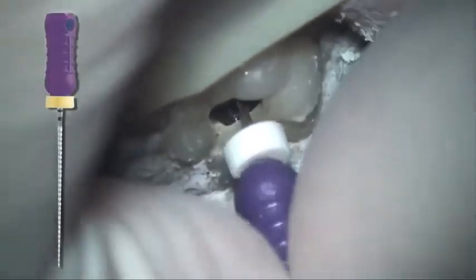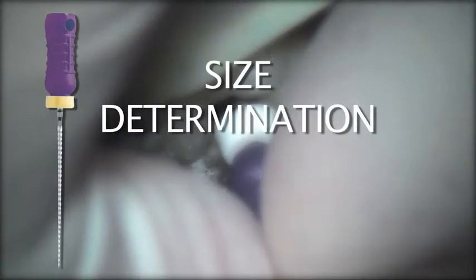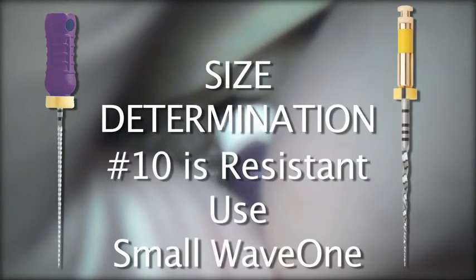Let's look at a clinical case using the Wave 1 file. It begins with establishing straight-line access and a reproducible glide path. This can be accomplished in a number of ways — path files can be used in sequence, and of course traditional hand files will accomplish the same goal. Once straight-line access is established, hand files are introduced to confirm patency and glide path. Begin with a number 10K file. If that number 10K file is very resistant to movement, the small Wave 1 file is called for.